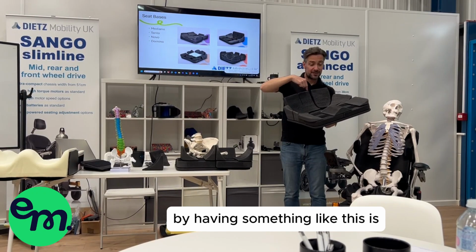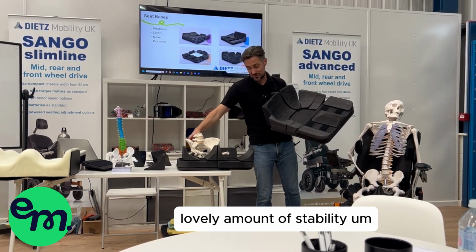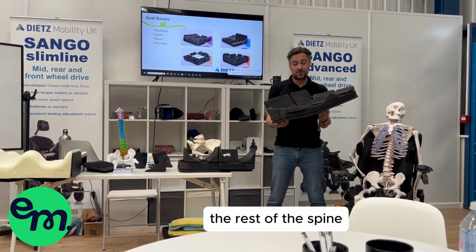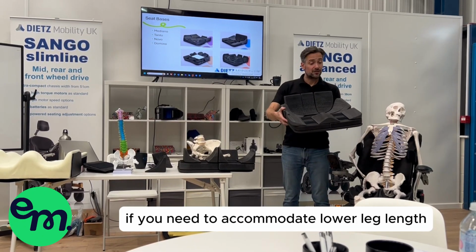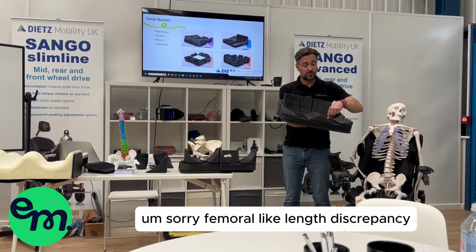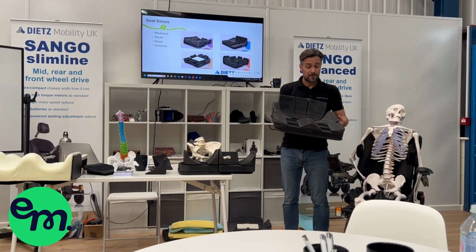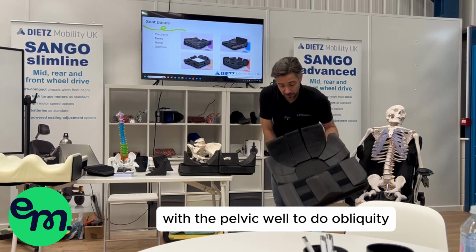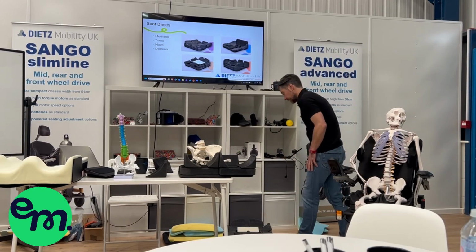By having something like this, it's starting the pelvis off with a lovely amount of stability, which is then easy to control the rest of the spine. If you need to accommodate lower leg length, femoral leg length discrepancy, we can adjust it accordingly, and play around with the pelvic well to do obliquity and rotation.